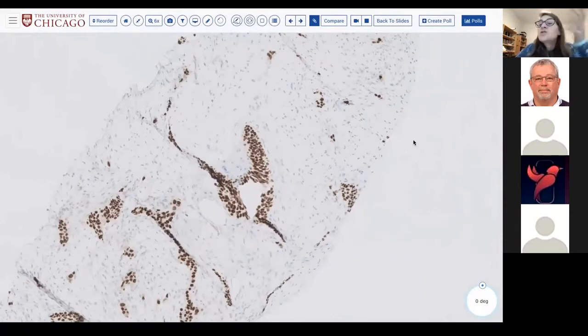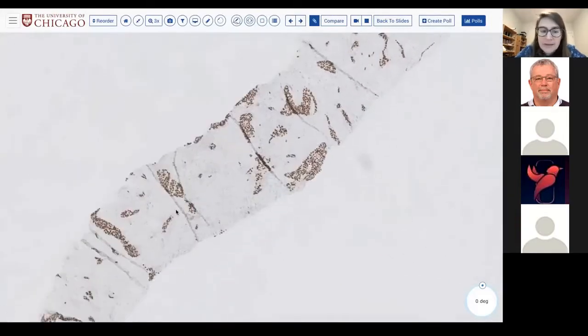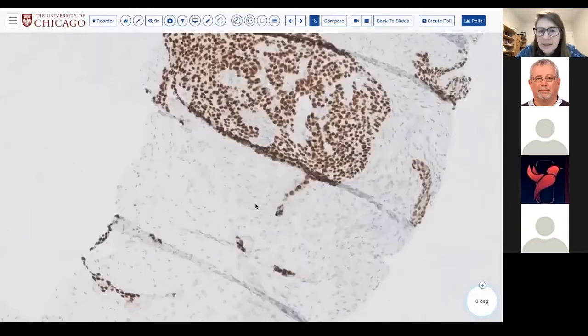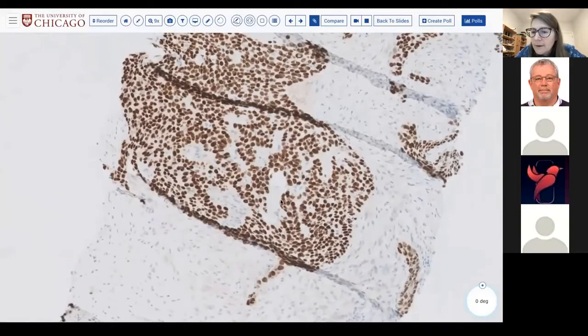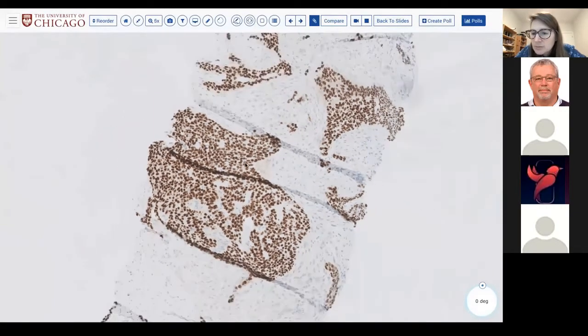Yeah, so certainly as a consideration of a metastasis from a sinonasal, I don't know, do they occur primarily in the parotid? You have to tell me. I've never seen one. Maybe. Right, because those could certainly be keratin and P63, P40 positive. Unfortunately, we did not do a CD99 in this case. All right. NKX negative.